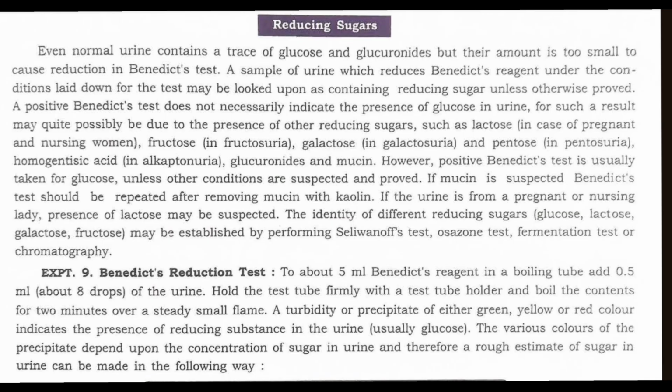However, a positive Benedict's test is usually taken for glucose unless other conditions are suspected and proved.